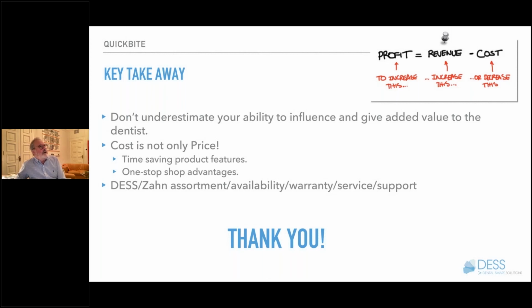Okay, so that's a good question. Basically, if you raise the gingival height or the collar height of the angled base, you also have to make the screw longer. And the consequence of that is that you can't angle it as much. So everything is a compromise from a geometric perspective.